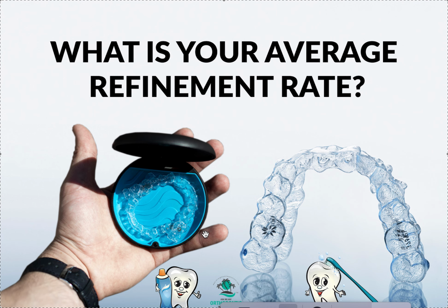The other benefit of making it longer is it actually doesn't make the plan longer, it makes the plan shorter, because things are more likely to track. Patient is happier and more comfortable. Patient isn't in as much pain. It's easier for them to seat them. They're more clean. They don't have to leave them in for 10 days, 2 weeks. They might leave them in for 5 days, 7 days.